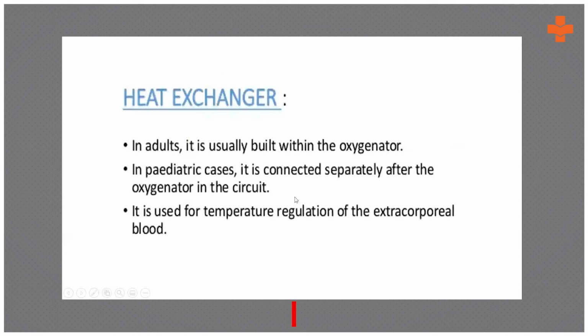Now, after the oxygenator, you need to heat the blood to body temperature. Ideally, the heat exchanger is built into the oxygenator. In pediatric cases, it is connected separately after the oxygenator in the circuit. It is used for temperature regulation in the ECMO circuit.